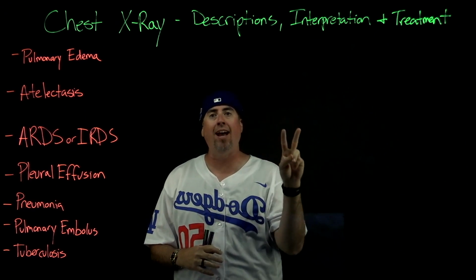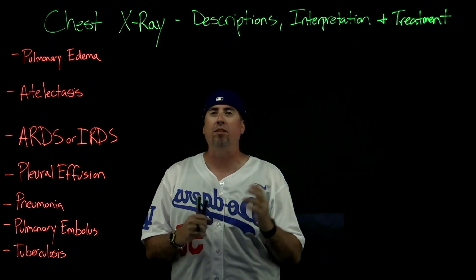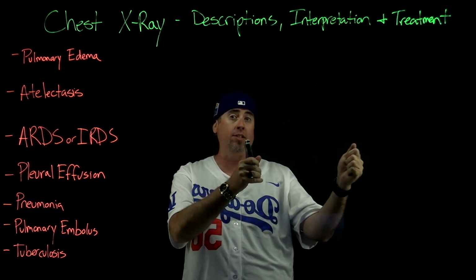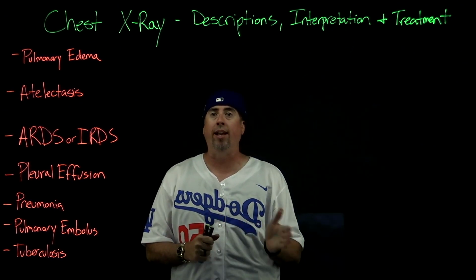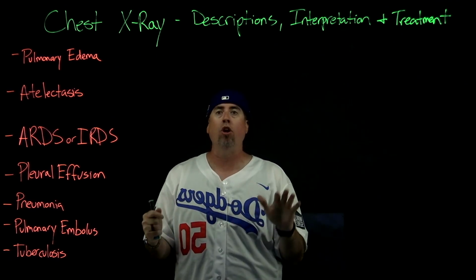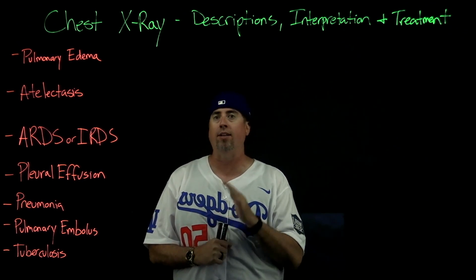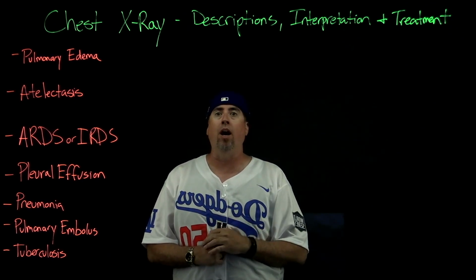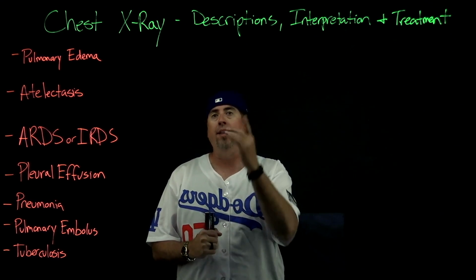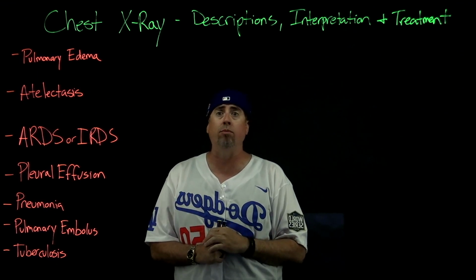All right, so if you're here for the chest x-ray, well, this is actually a part 2 video. We did a part 1 video that's more about interpreting chest x-rays, where you get x-rays and need to see some landmarks and key terms. This is more of a descriptive part 2 video to the chest x-ray radiograph video, and we are also going to include some treatments.